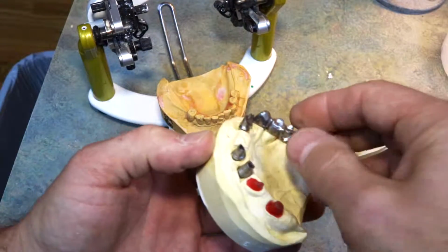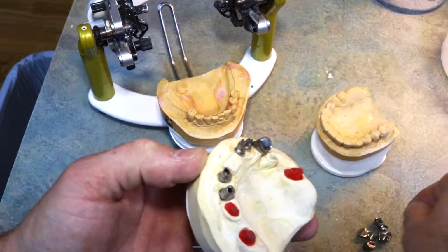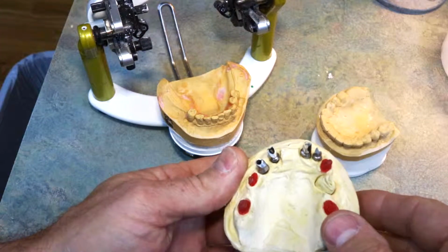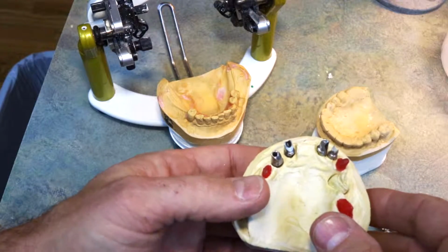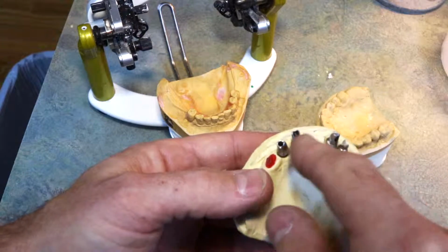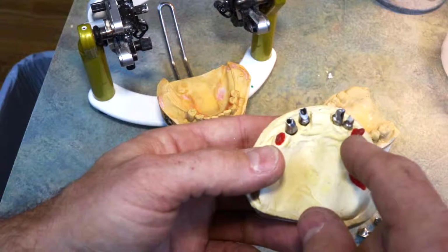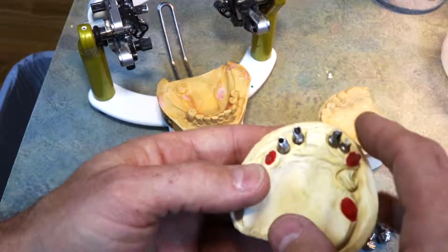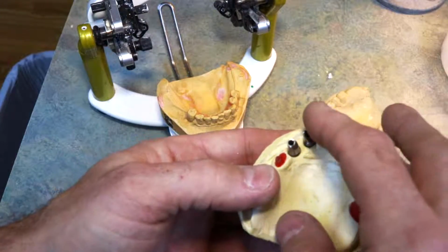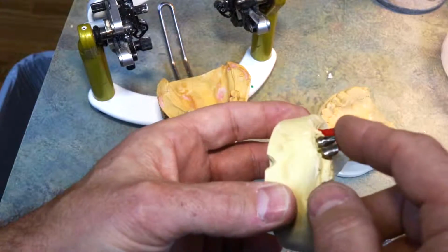So at this stage that I'm at the moment, this framework is done, the post and core is done, and we have the custom abutments. Now, the next thing I need to do is tap some screw threads into these custom abutments. We want to do this as a screw-retained case, and this doctor wants to tap screws into these abutments. So now that these have been done, these have been verified intraorally.